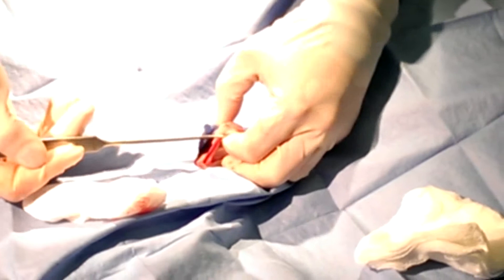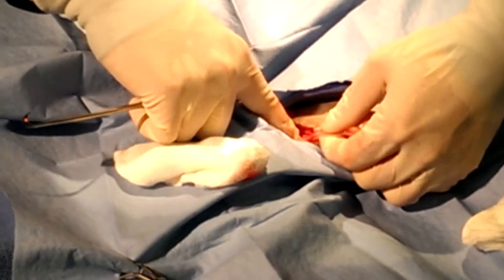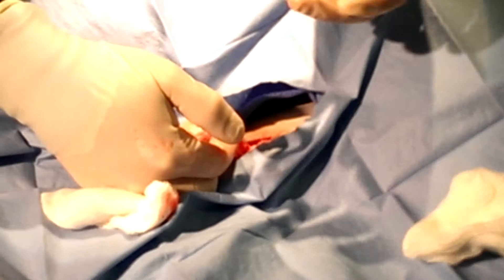If you look at what I'm doing — this is one of the uterine horns. I already found the bifurcation. This is the other uterine horn coming out in this direction. That way will be the cervix and we'll get to that. At this point you need to be more careful because we need to break a ligament but not tear things — this is where bleeding can happen.